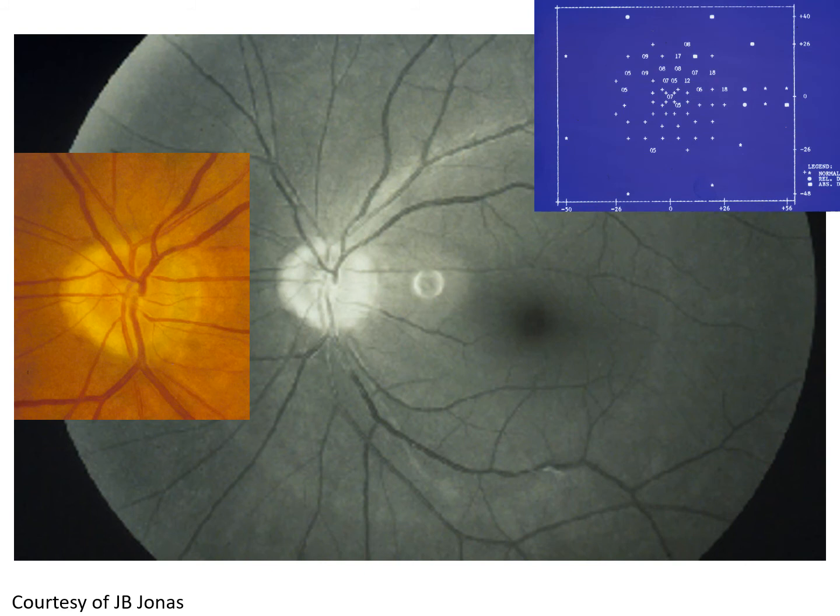And if you perform a visual field, you can observe a nasal step and an arcuate superior sector defect.